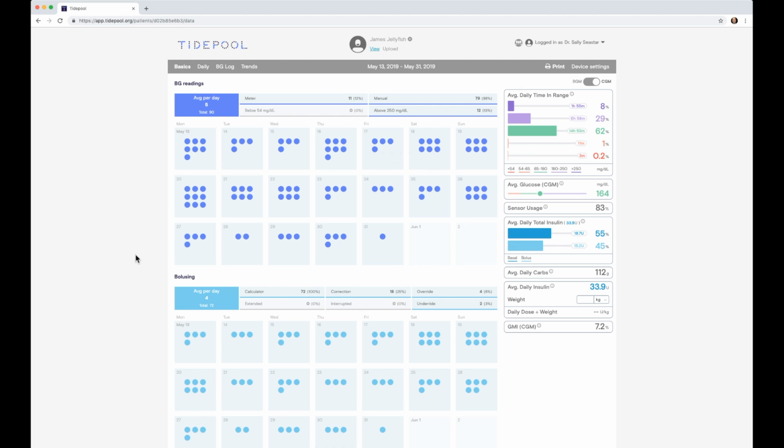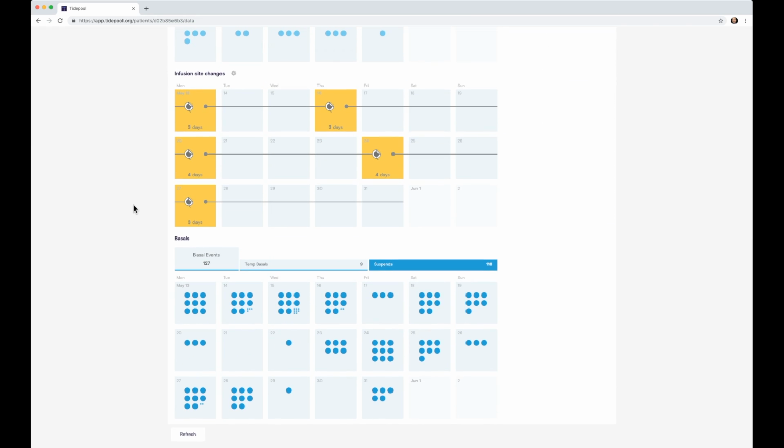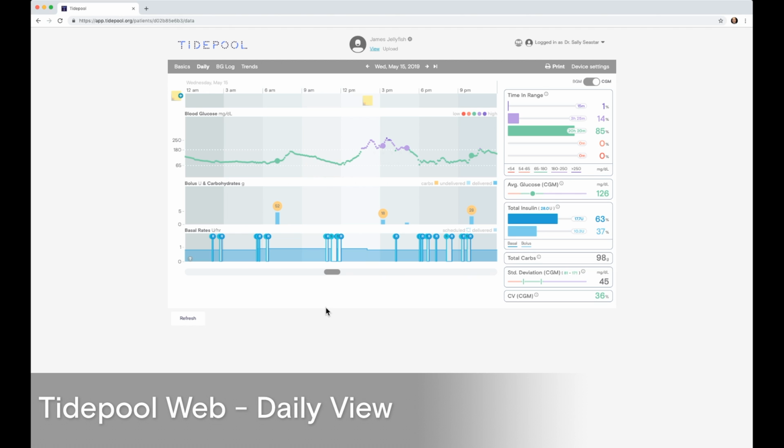Everything we've seen from the Trends, BG Log, and Basics views will all link back to the daily view with a simple click. For example, this day on May 15th looks kind of interesting with its 16 automatic suspend events. We can click on this and take a deeper dive into what's happening here within the daily view.